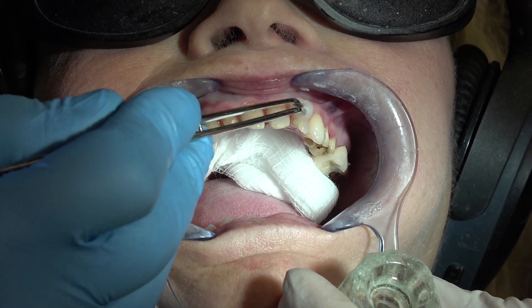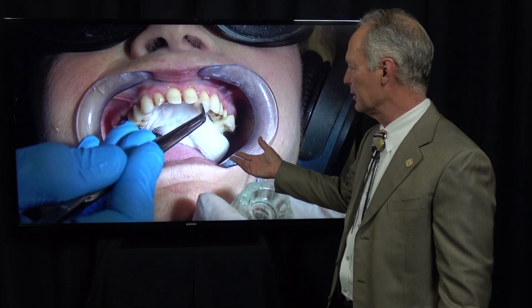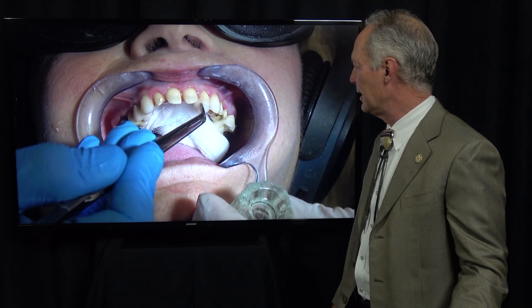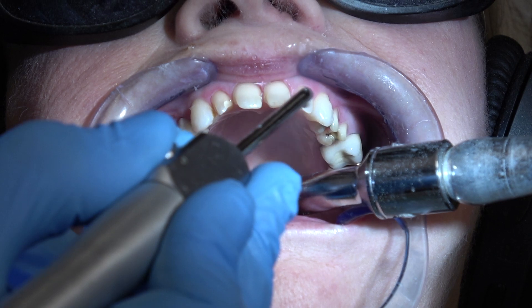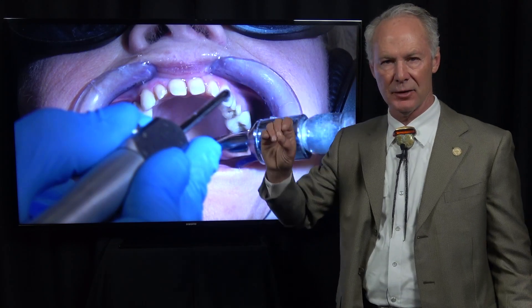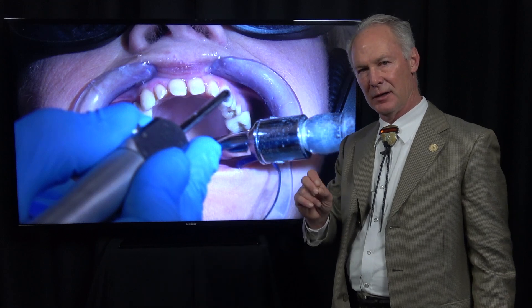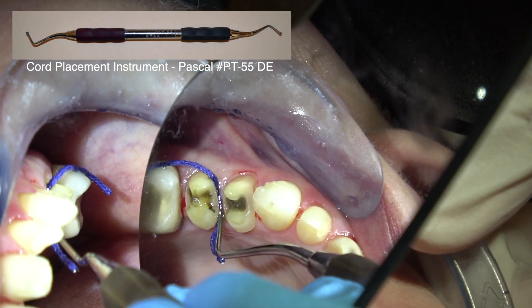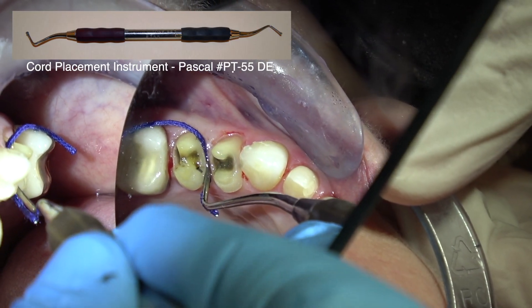I'm wiping the teeth with water or you can use tubulicid red — something to dampen them. I never want to put gingival retraction cord into a dry sulcus, as it could tear the sulcus or tear the gingival tissue and cause bleeding.